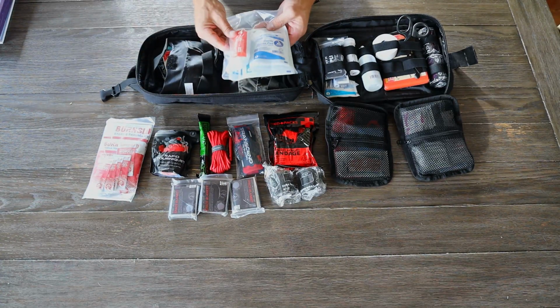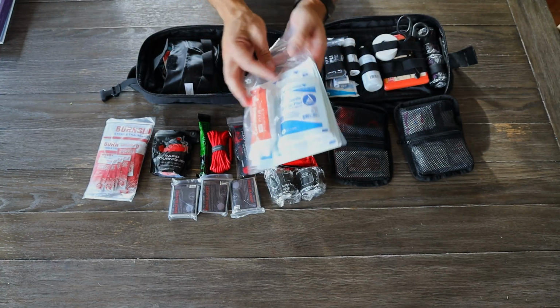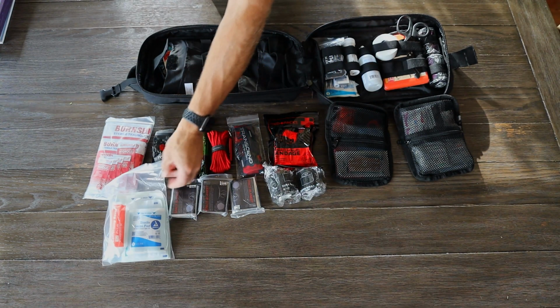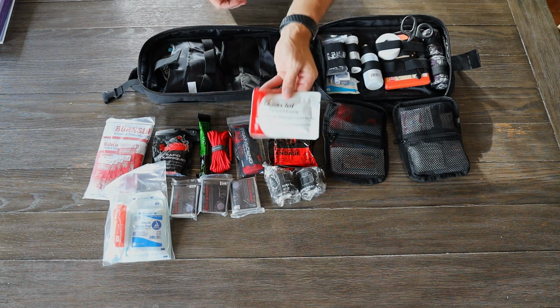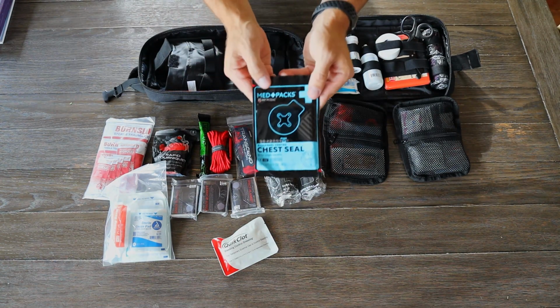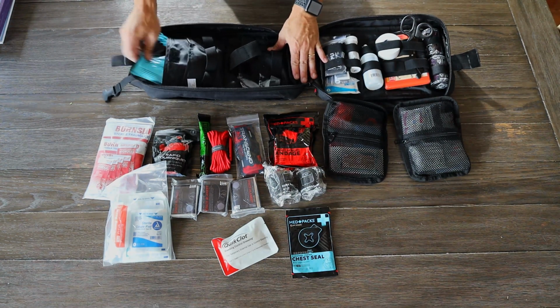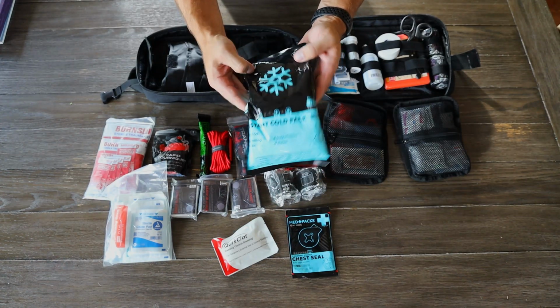Now coming up here, you have a variety of gauzes, so from a wrap and then different sterile pad sizes. So again, a couple different options depending on the size of the injury. And there are multiples of each size inside there, so you have a couple different options. Bleeding control dressing. So this one's got some treatment on it for bleed control. Here, especially if you're using this at the range or any kind of penetrating injury, this is a chest seal. Could be a lifesaver in case of a penetrating chest injury. And then instant cold pack. Now this definitely is useful.